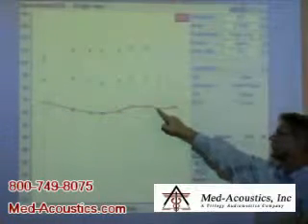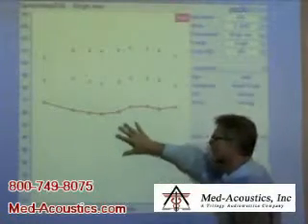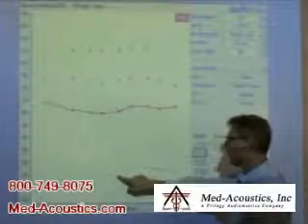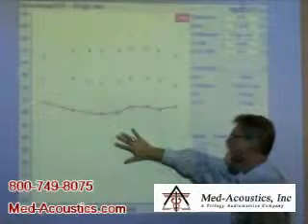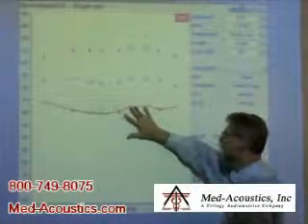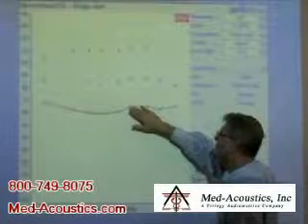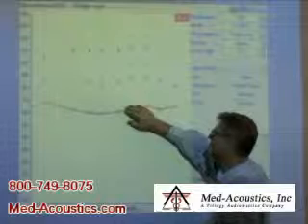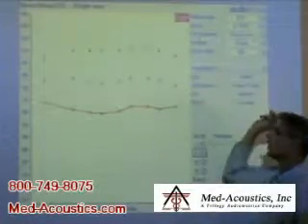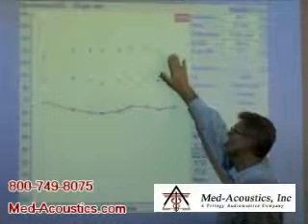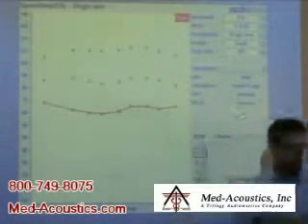This line represents the patient's audiogram. This area below it is not audible to this patient - these are his thresholds. Normal thresholds are down here; things below them aren't audible to someone with normal hearing either. These plus signs are targets - we want to make average speech not just audible but comfortable, about 10 to 15 dB above threshold. These are the UCLs - uncomfortable loudness levels - and we want to make sure loud sounds don't exceed those.